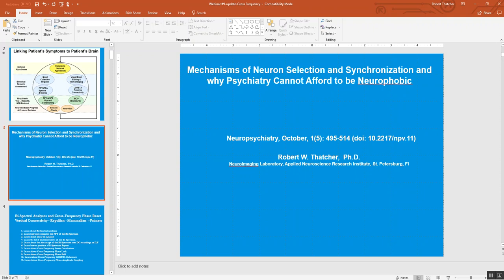What's important, and I'll be emphasizing this throughout, is still location, location, location, and not necessarily frequency, because every node and module and cluster of neurons actually communicates with other clusters of neurons at different frequencies. And they're completely capable of generating a broad spectrum of frequencies. And so location is what's important, and whether there's dysregulation expressed in a delta or a theta or alpha band in the hippocampus or the cingulate gyrus is much less important than the location itself.